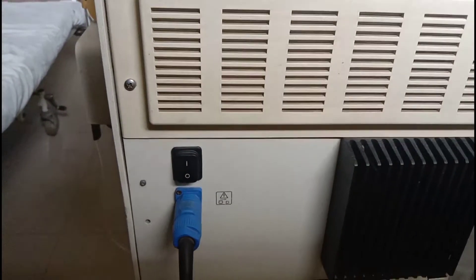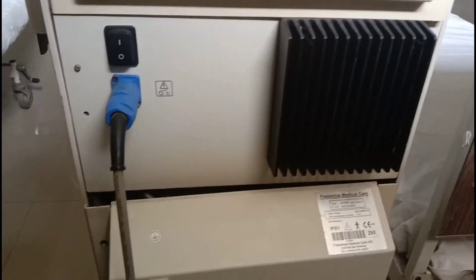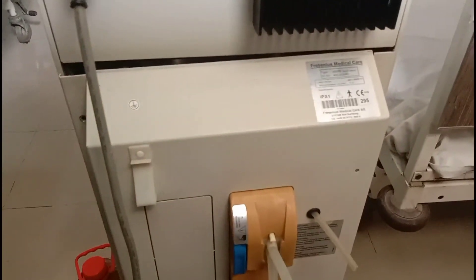Here you can see the rear view of the Fresenius hemodialysis machine. You have already seen the front view; here you can see the back side view of the Fresenius hemodialysis machine, that is the 4008S model. Here you can see how many hours the machine has been operated.